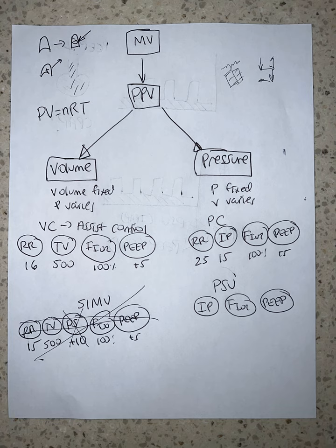I am starting a new series on the podcast of various lectures that I give during my clinical rotations so that you can benefit as well. Today we are talking about mechanical ventilation, ventilators, and the principles and the different modes. This is a beginner's lecture, nothing that a fellow would use, but definitely good for medical students, residents, PA students, nurse practitioner students, and other APP students as well.